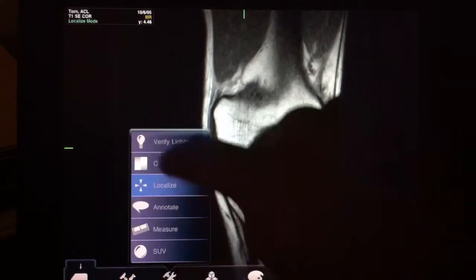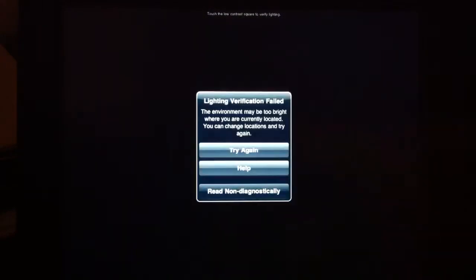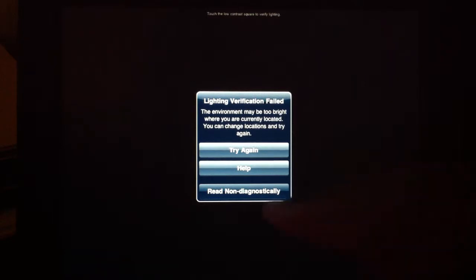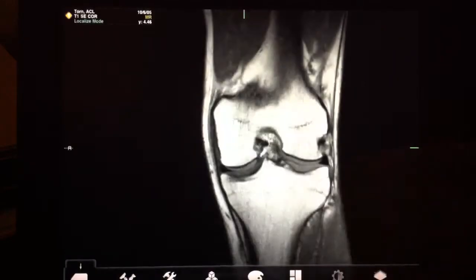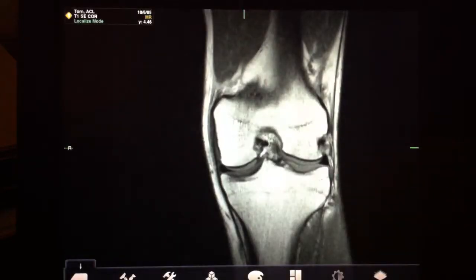If you try to verify lighting and you can't find the rectangle, it'll put up a warning and say that it has failed verification, but you can continue to read non-diagnostically.